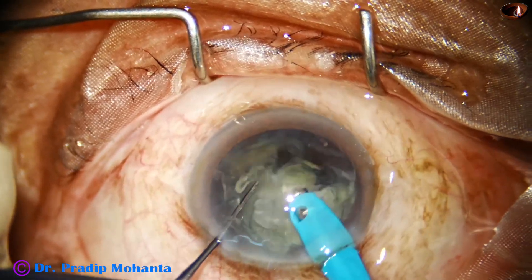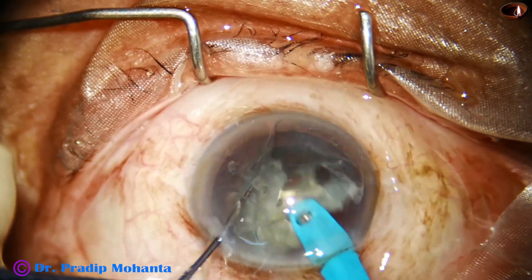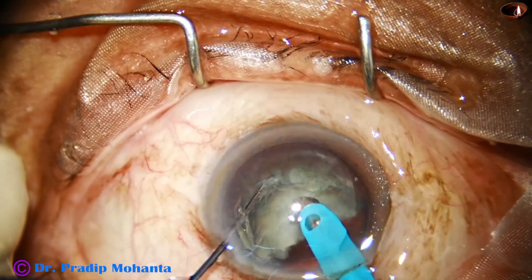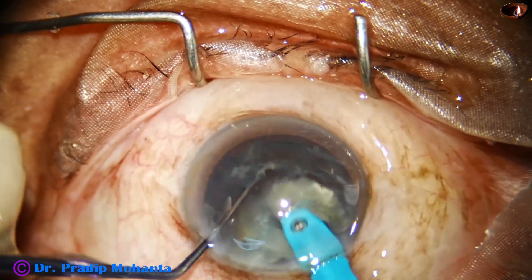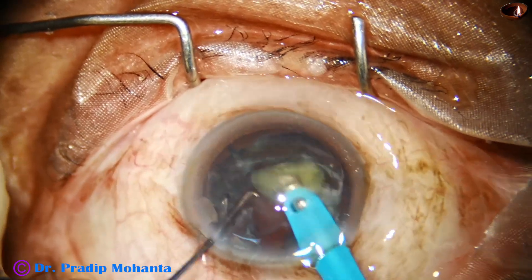Emulsify this piece of nucleus, and then the other part of the hemi-nucleus. Come to the other hemi-nucleus, chop it at the middle and start emulsifying the piece, and then the last quadrant.